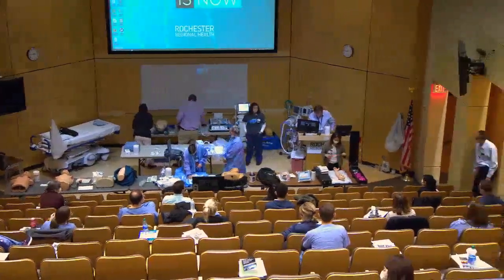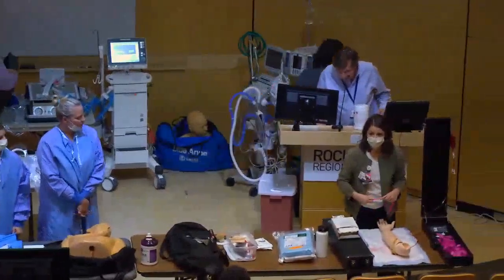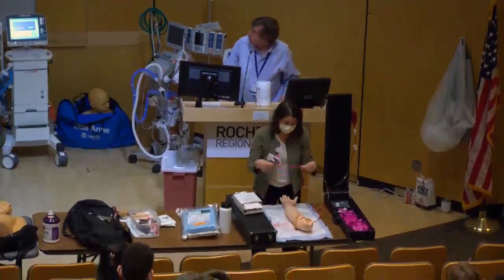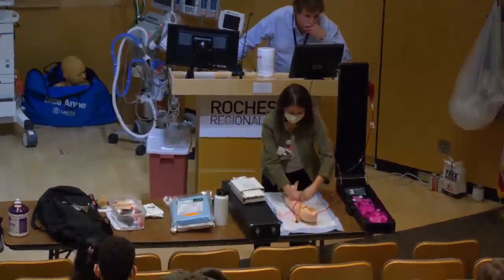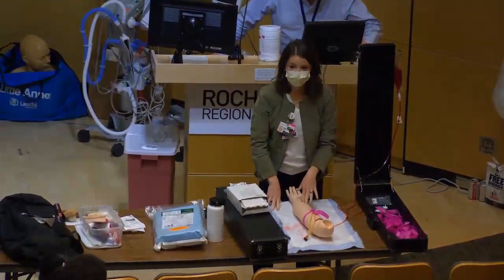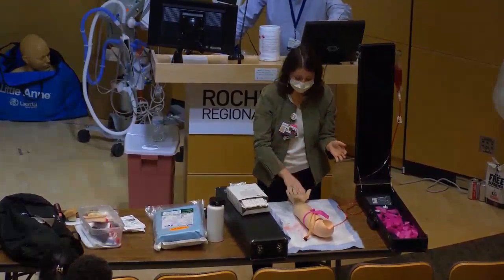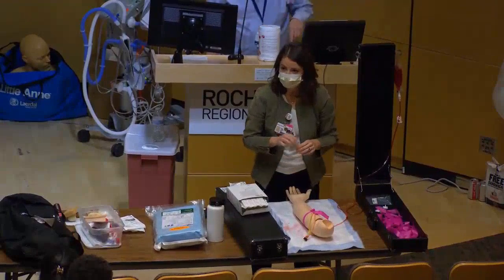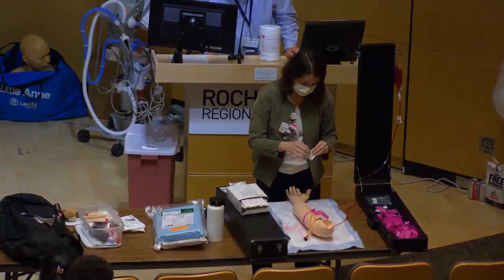For a peripheral IV, anything less than a 20-gauge is not very helpful given the rates at which patients get antibiotics and fluids. You'll place a tourniquet around the patient's arm — it needs to be a little snug — then assess the arm. Go more off of touch than sight; you're looking for something bouncy that springs back when you press down.